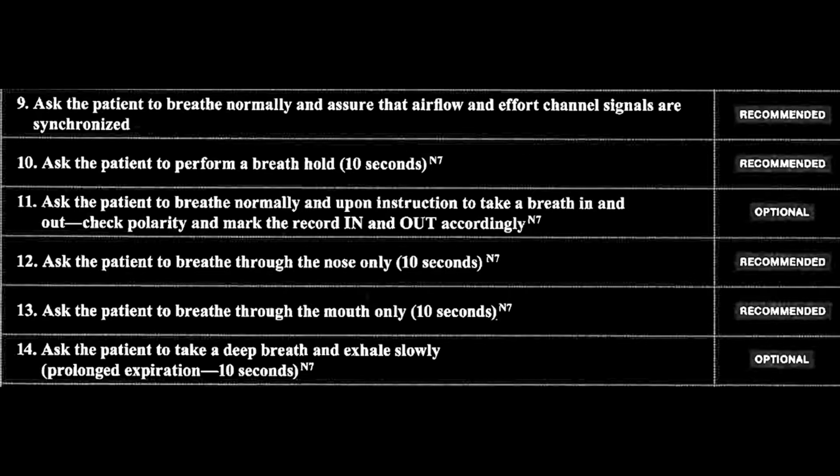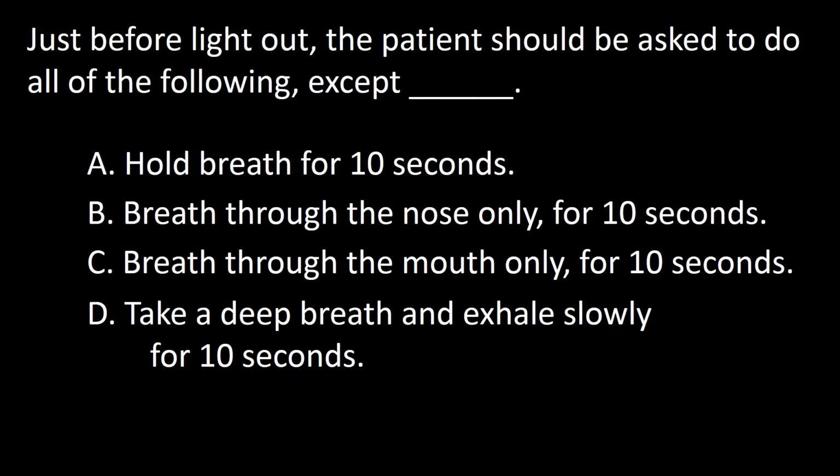The recommendations in this frame are obvious for those that can follow commands. The arrow points to optional. This, as we have mentioned, implies that the decision to do it or not depends on the neurophysiologist heading the lab. As you can see, asking the patient to take a deep breath and exhale slowly, that is, prolonged expiration for 10 seconds, is optional. So the answer to this question is D.